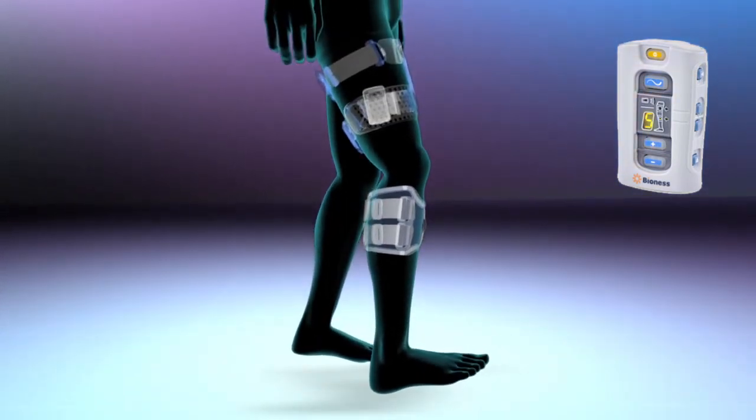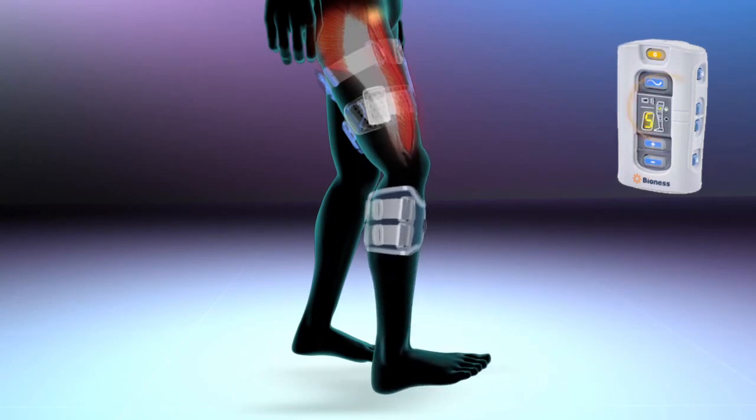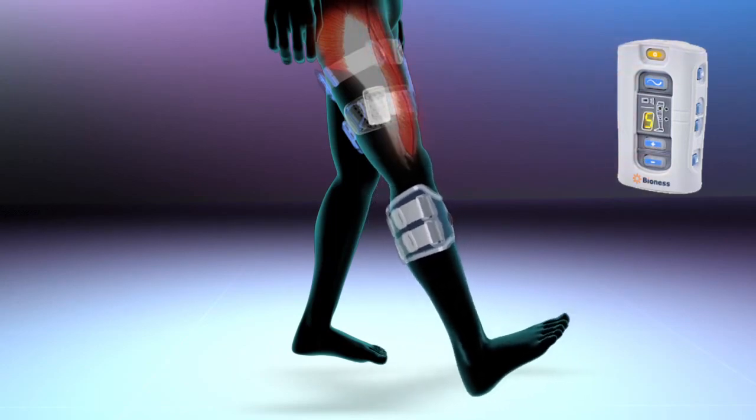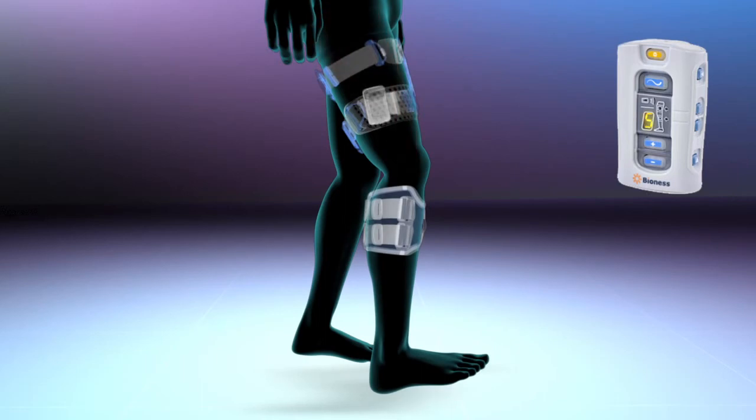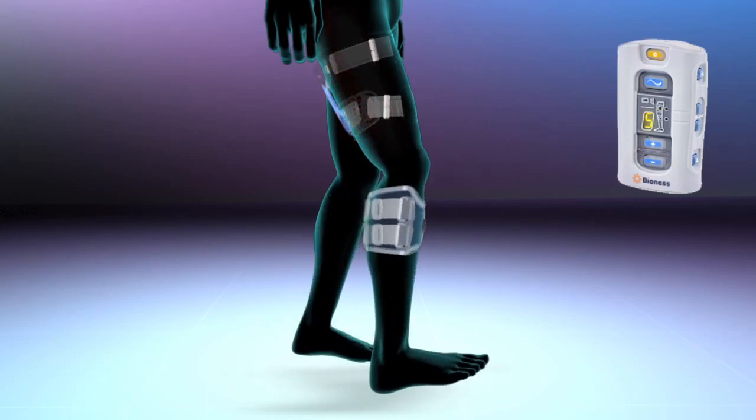The pulses from the thigh cuff activate the nerves, stimulating the quadriceps muscles that cause the knee to extend at the appropriate time during gait. The thigh cuff may also be worn on the back of the leg, stimulating the hamstring muscles that cause the knee to flex at the appropriate time during gait.